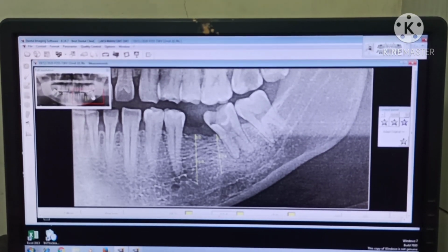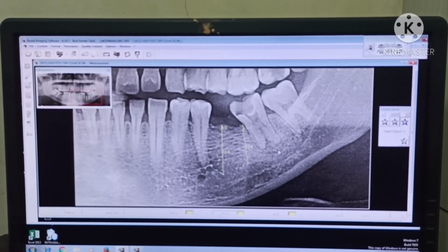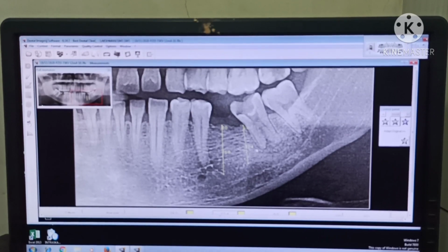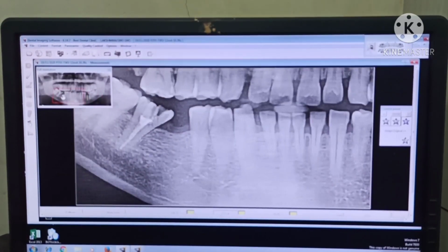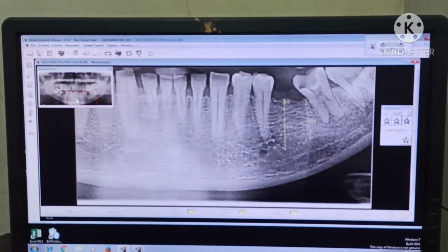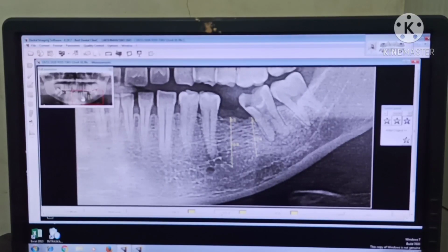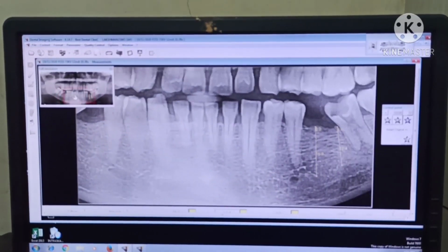The main thing here is to palpate the lingual ridge, whether it is available. If it is available, you can take advantage of this. On both sides we are going to use a single piece implant, with compression screws. We are not going to use BCS here. And for this case, 8 we are going to retain it.